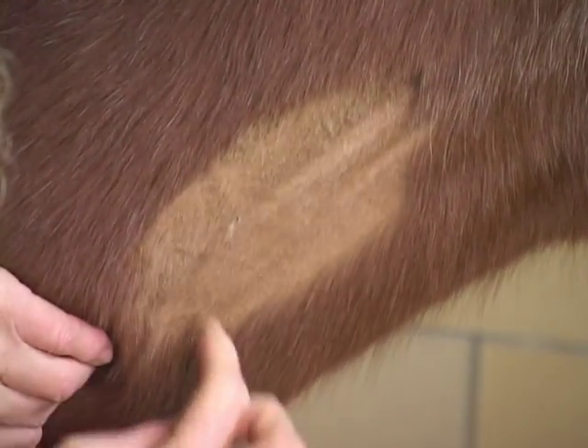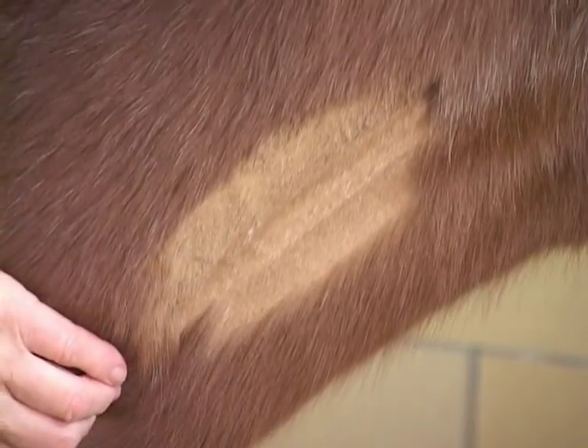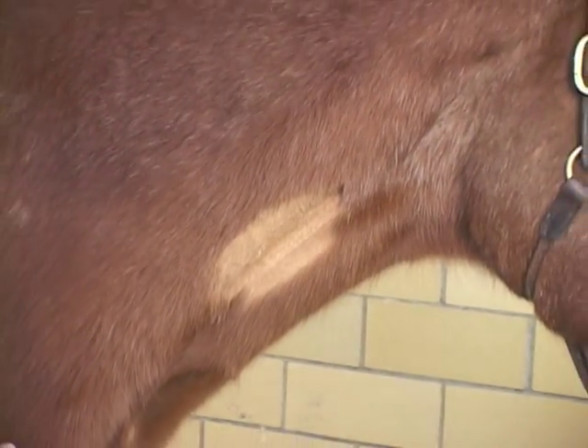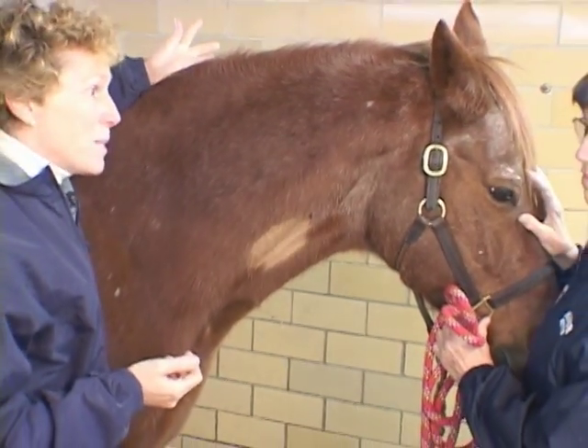Right here, middle third of the neck — after you clearly see the vein — is where you're going to be putting the needle in, either to draw blood or to give an IV injection. He does have great veins. Let's show the unclipped side where it's going to be a little harder to see, because in reality on a patient, that's the side you're going to be sticking.